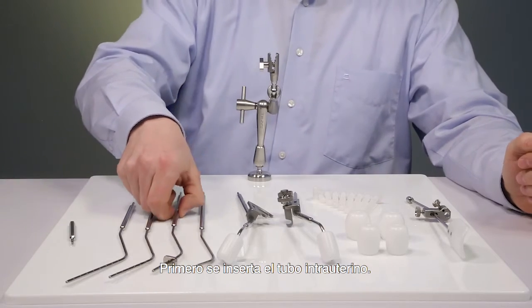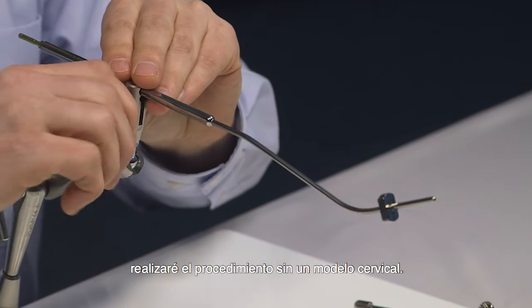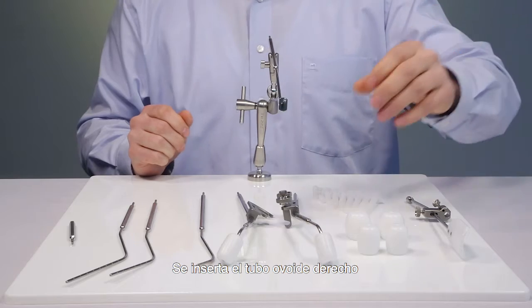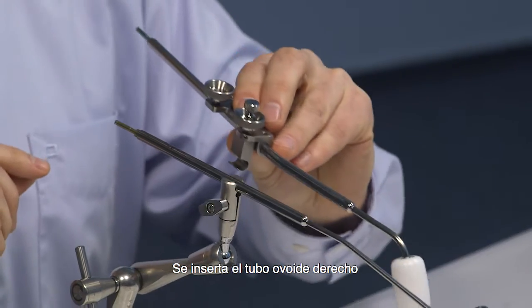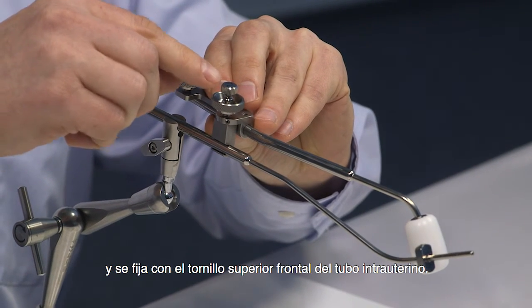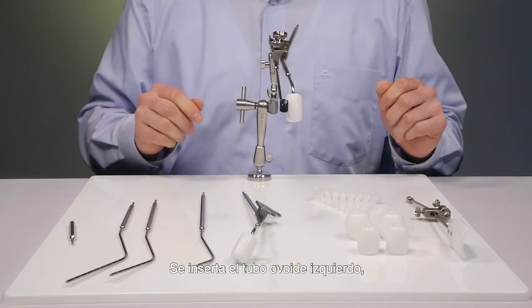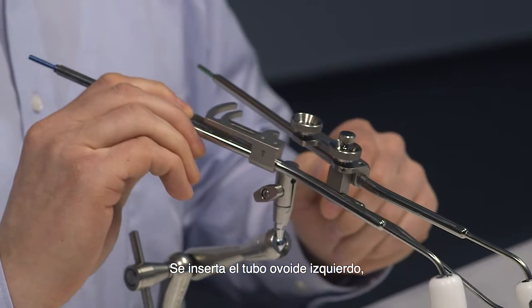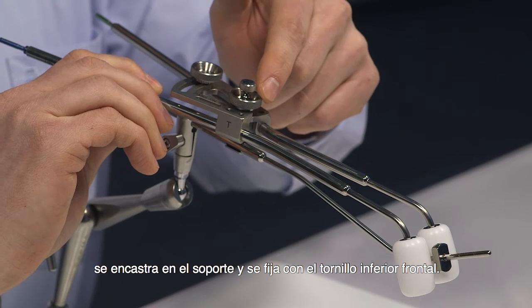The I.U. tube is inserted first. For demonstration purposes I will do this without a cervix model. Now the right ovoid tube is inserted and fixed with the upper front screw on the I.U. tube. Now the left ovoid tube is inserted and clicked into the bracket and fixed with a lower front screw.